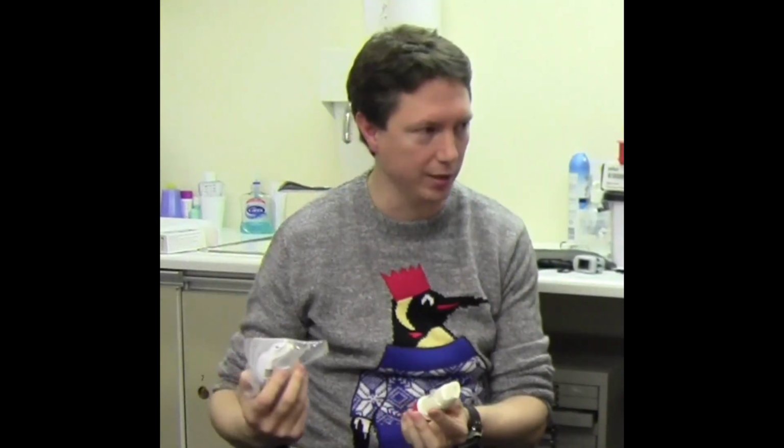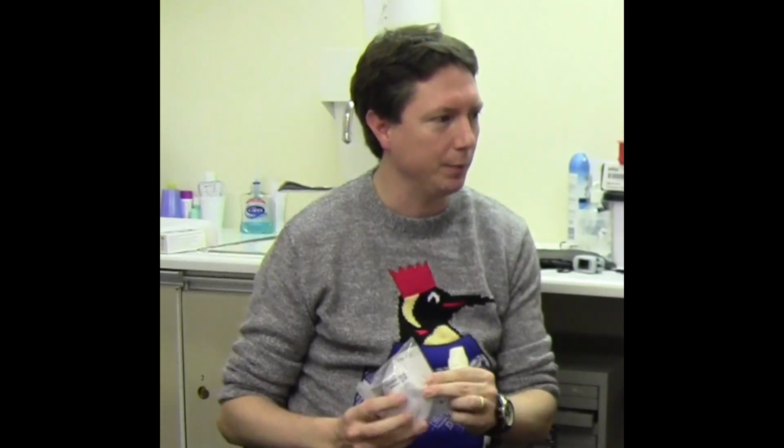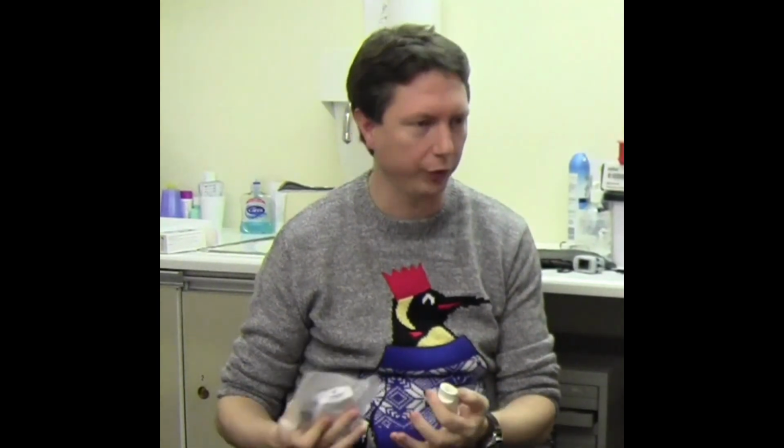There are different ways of evaluating whether the patient's using it correctly, and that's watching the patient, talking them through it, and maybe even using something like the In-Check device to see if they've got enough puff or flow to make that work well for them. The other thing patients can benefit from is trainer devices. These ones are just for the Turbohaler and for the Ellipta device, and they give out a whistle so the patient knows they're using it correctly. And there's various other devices out there that can help patients use their inhalers properly.